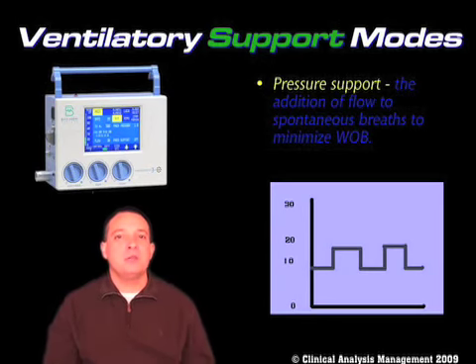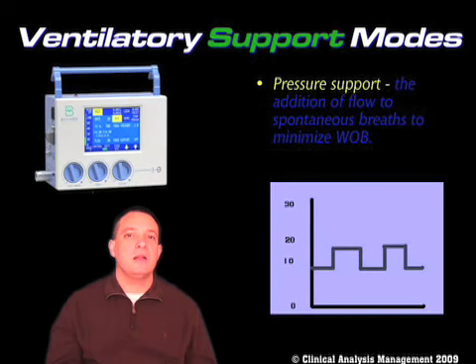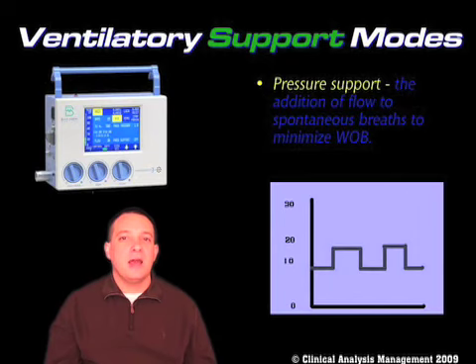And if you have a patient who is in SIMV and the patient is spontaneously breathing, if they're not paralyzed for some reason, if that patient is being allowed to overbreathe the ventilator, which is what we should be doing if we're using the ventilator appropriately, then every time a patient is in SIMV, they should also be getting some pressure support.